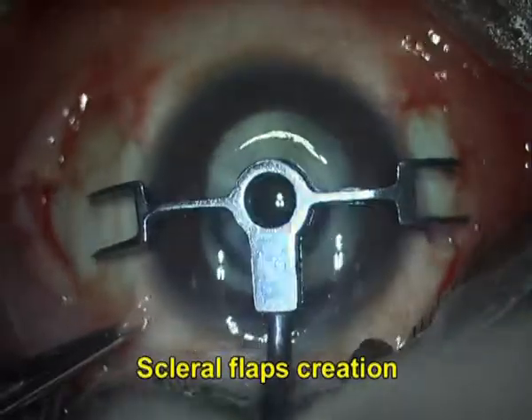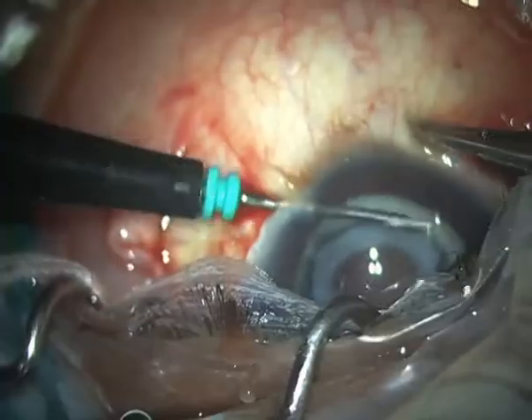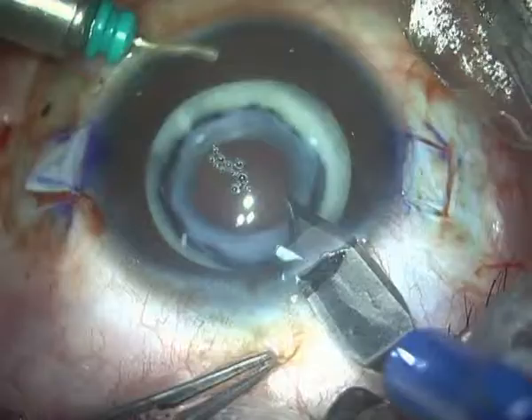Let's look at the case of the Soemmering ring. I'm making scleral flaps 180 degrees apart, placed my trocar AC maintainer, and made my sclerotomies under the flaps.